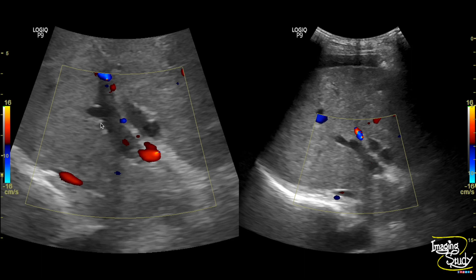Here you can see the portal vein with no flow within the lumen, and the dilated common bile duct anterior to it. There is flow within the hepatic artery. The liver parenchyma is slightly heterogeneous and ascites is seen.